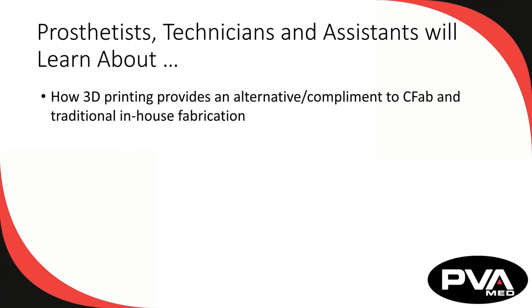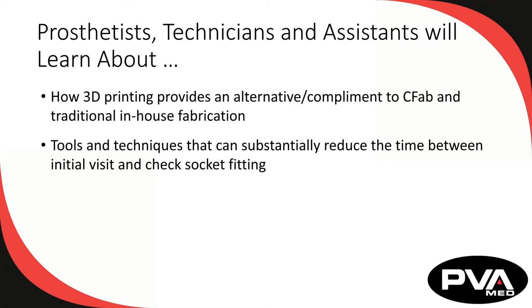Participants will learn how advances in additive manufacturing and materials are providing an alternative, or in some cases, a complement, to using central fabrication services or traditional in-house fabrication techniques. Participants will also learn through discovery of tools and techniques that can be used to streamline the time between the initial patient consultation and the check socket fitting, even in environments with limited technician resources. Oftentimes, this can reduce the time frame from days or weeks down to even same day should circumstances dictate.